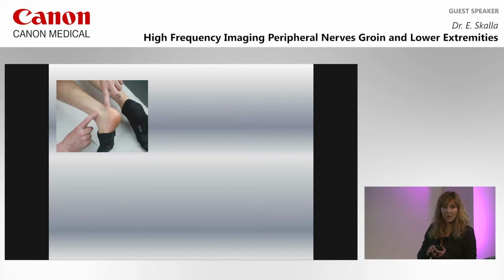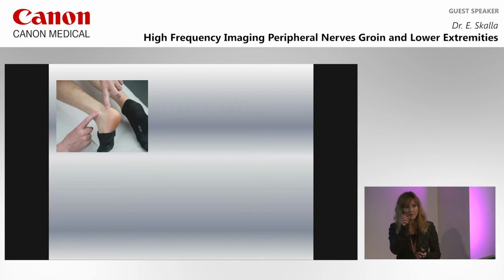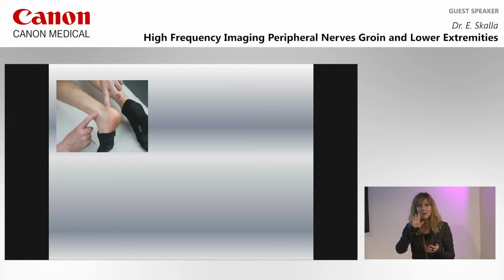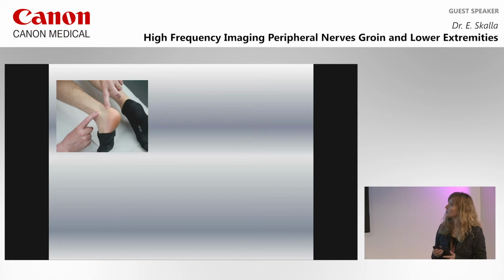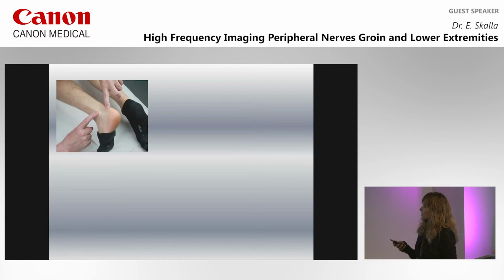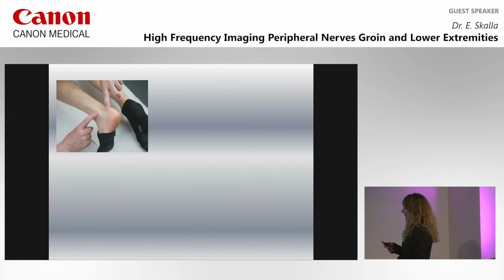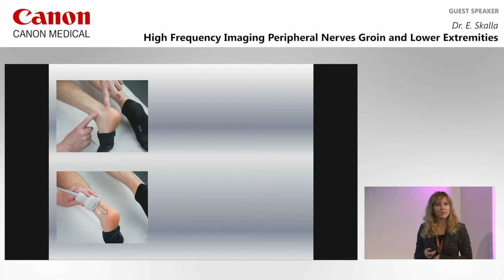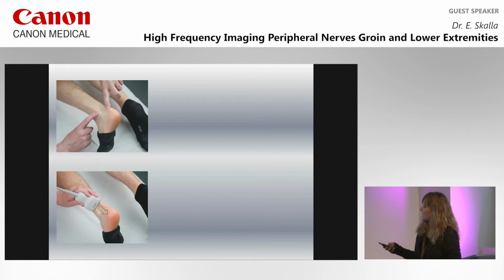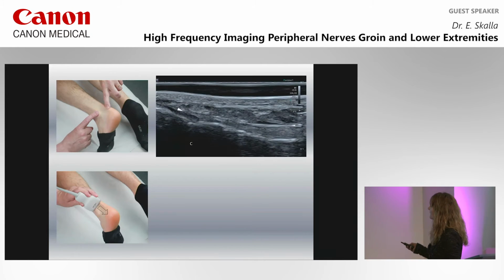We also have now the hockey stick probe. It's easier with it. It has this small contact, and it's very beautiful to do the ultrasound in this region with the hockey stick probe. You just move your probe downwards along the Achilles tendon in this groove, and somewhere here the branches should leave the main stem.